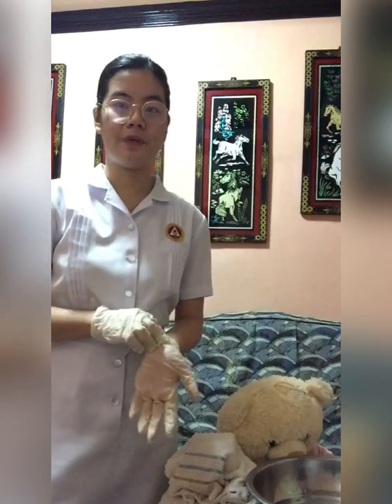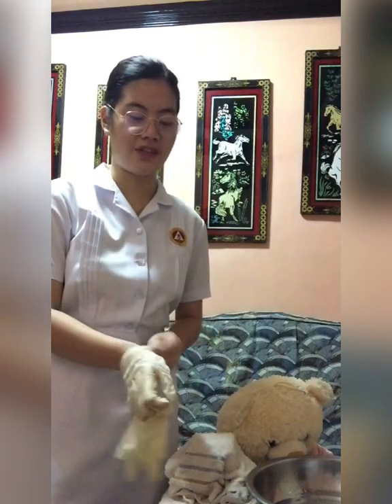And then wrap the cool water flow pad with a towel or in a pillowcase, and then wrap the cool pad around the body part, and then turn the device on and set the correct temperature. Secure with elastic wrap, bandage, gauze roll or ties, and then remove gloves, dispose of them properly, and then perform hand hygiene.